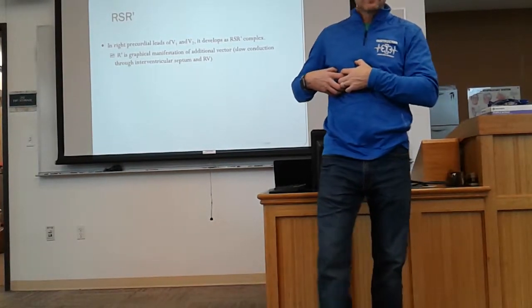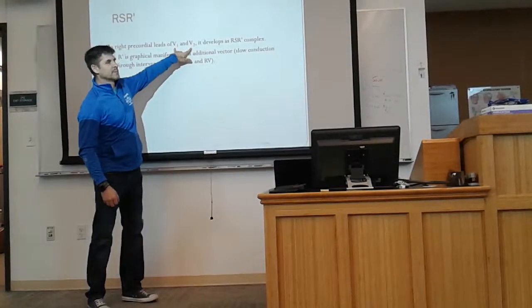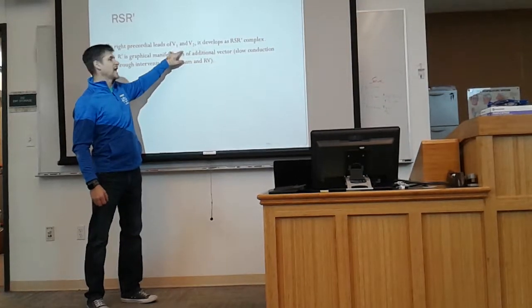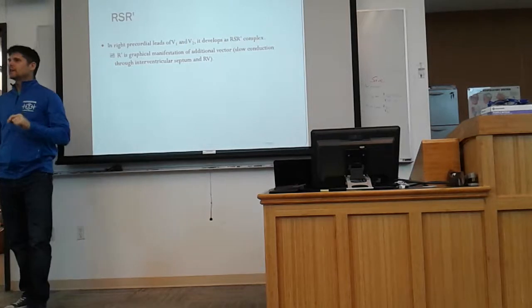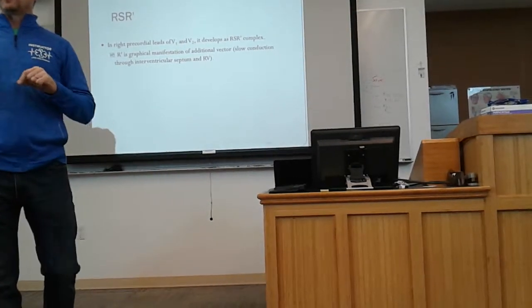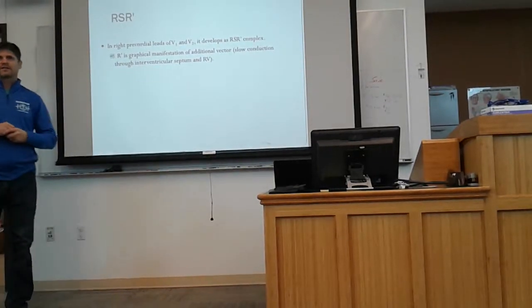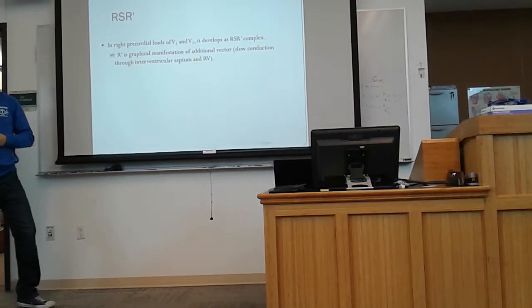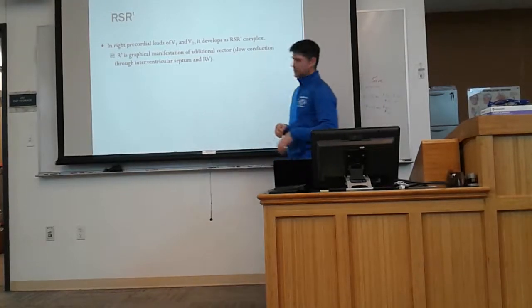Does that make sense? So we look at V1, sometimes V2, because V2 looks very closely to what V1 is looking at, but V1 is our big one. We look at V1, and we'll often see clear double QRS patterns. A left-sided QRS and a right-sided QRS. Does that make sense? Questions on that? We good?